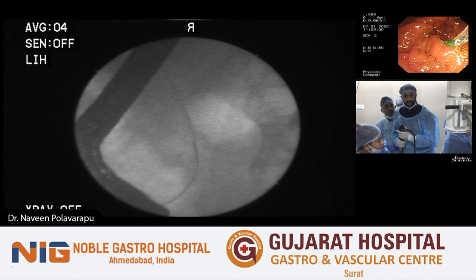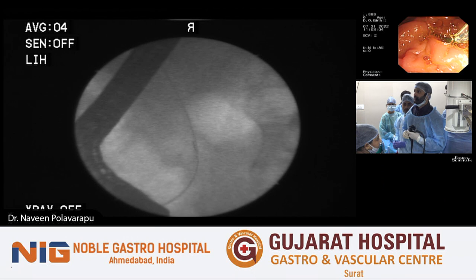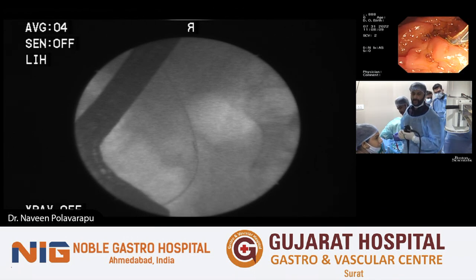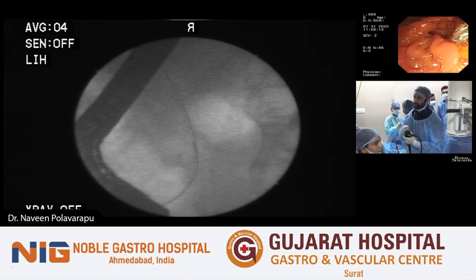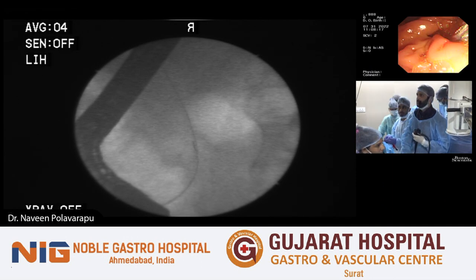More than stone, what we have done is intrahepatic stricture. When we put in a cholangiogram, give a light cholangiogram, not too much. Everything, the Spy and everything, turned out to be IgG4 related disease. Just one stricture in the left segmental duct, and then it was IgG4.